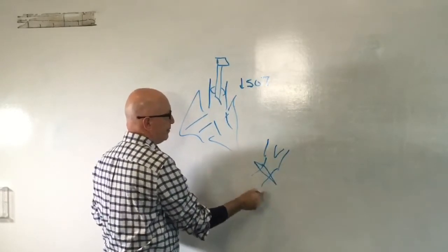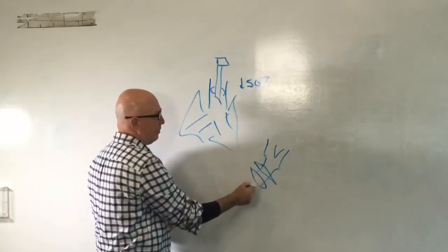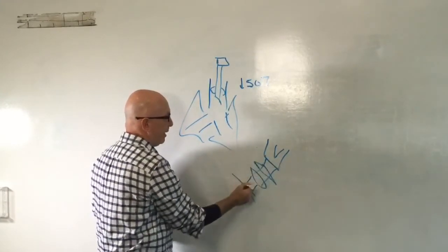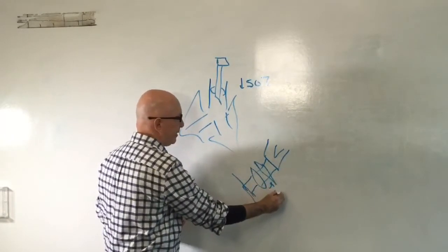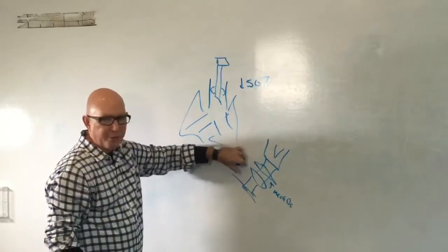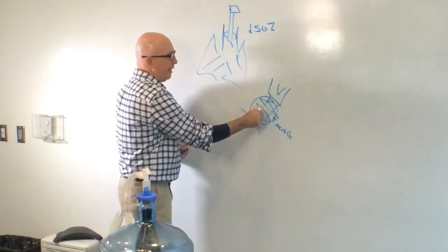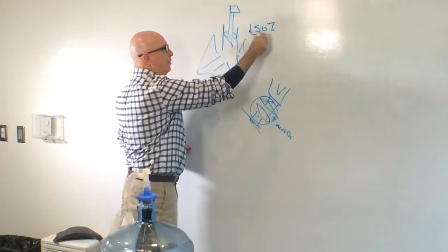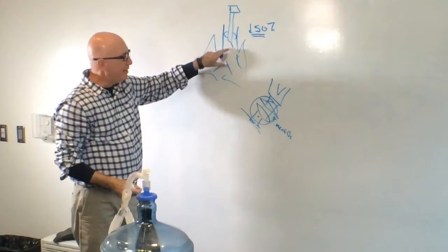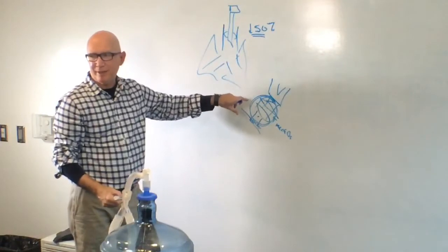There is our adapter for our end-tidal CO2, there's also our heat moisture exchanger, and then there's also our inline suction catheters. Every single one of these pieces increases the mechanical dead space. And the thing is that if you use the appropriate size piece for your patient, then the volume that you add will pretty much make up for what you lost when you intubated the patient. So the 50% less of your anatomical dead space, you're typically giving back to the patient with mechanical dead space if you're using the right bits of equipment.